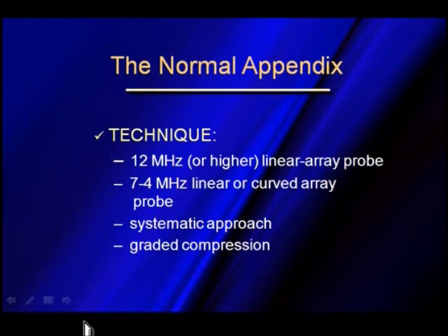Now, talking about the technique, you want to use a high-frequency linear array transducer. And even on patients that are fairly heavy, I'll at least start out with a high-frequency probe. In the second half of this lecture, we're going to actually talk about inflamed appendix, and you'll see the importance of using the higher frequency transducer and looking at that. If I need to switch to a lower frequency transducer for better penetration, I actually prefer going to a curved array transducer rather than the linear array, just because I get a wider field of view that way.